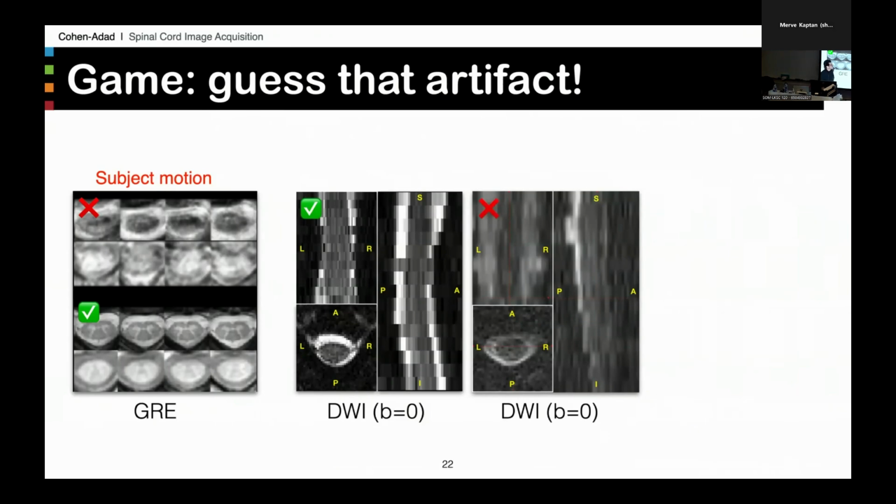We see that the image is a bit darker. In some parts of the image, the signal is attenuated. What's happening? Shimming? Yes, shimming. And more specifically, how could poor shimming cause this?